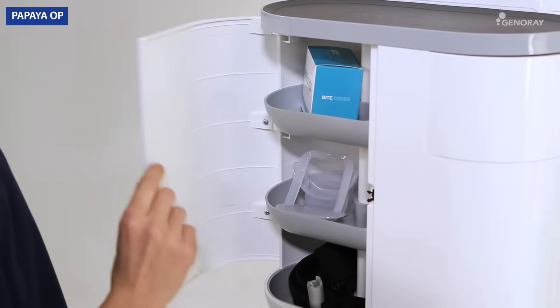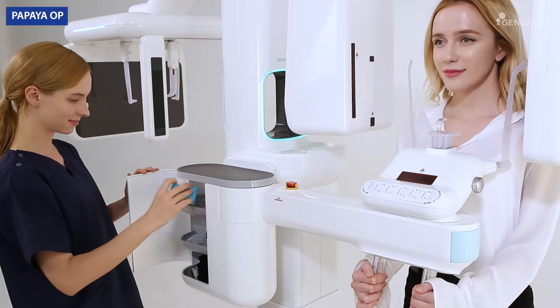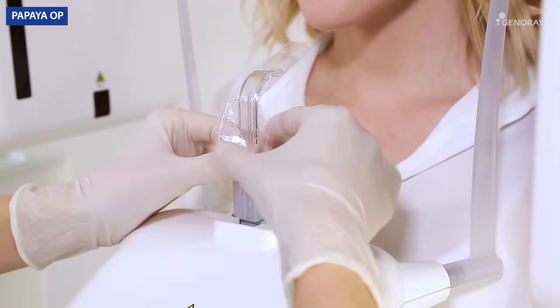Plug in the proper bite block and bite stick. Apply a bite cover to prepare for the scanning.